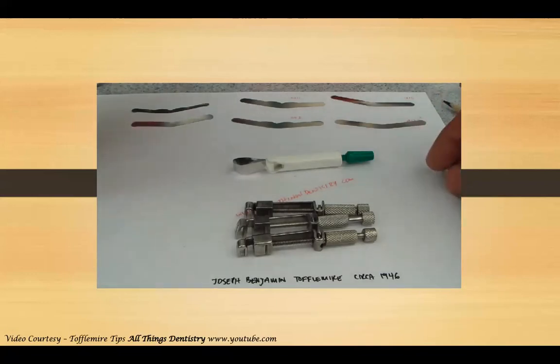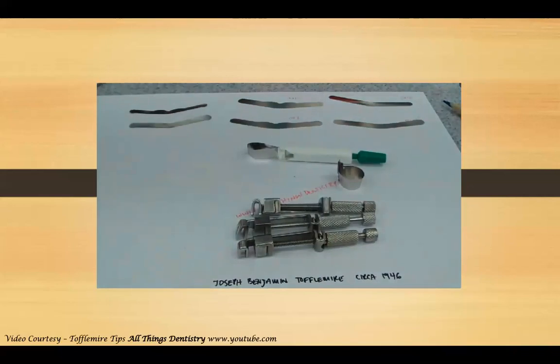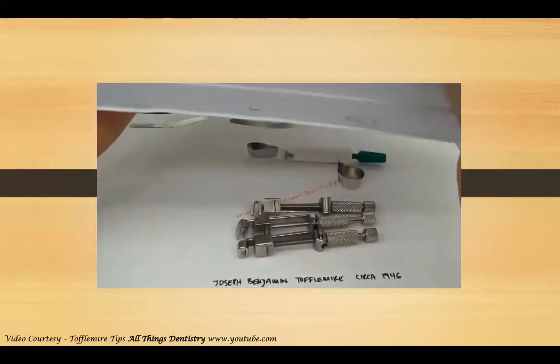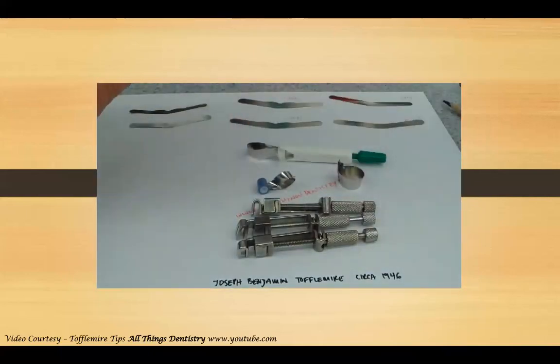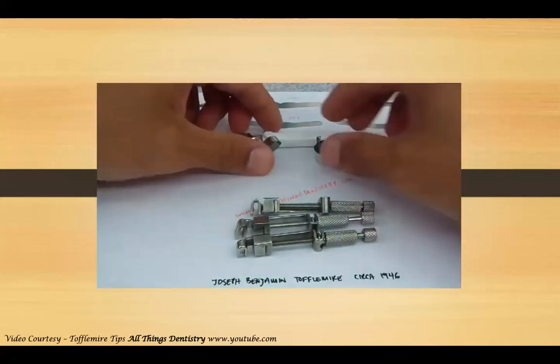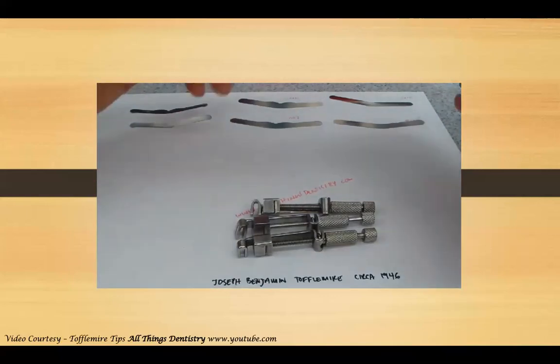There are definitely many, probably thousands of different brands out there. This is the Omni Matrix. There is the Auto Matrix. I have another one here. There's a Palodent, but that's difficult for complex cases. This is the Super Mat. Essentially, stainless steel matrices with some sort of holder and a tightening system. Just about the Tofflemire matrix, I really just learned about it myself this past week, reviewing and asking for some other hints.